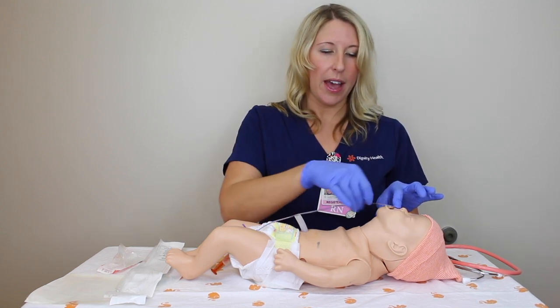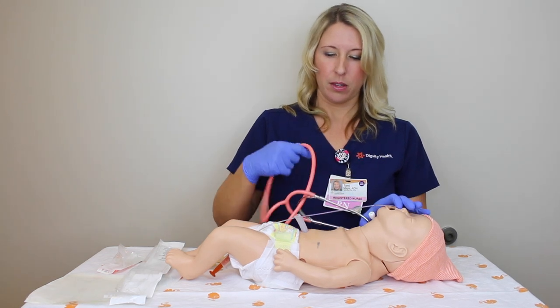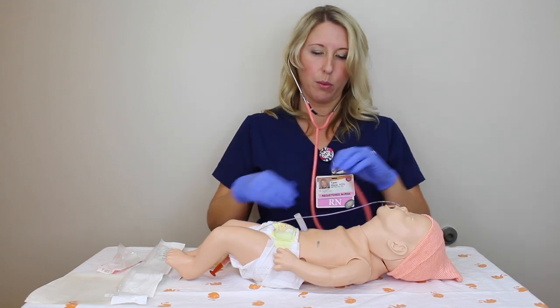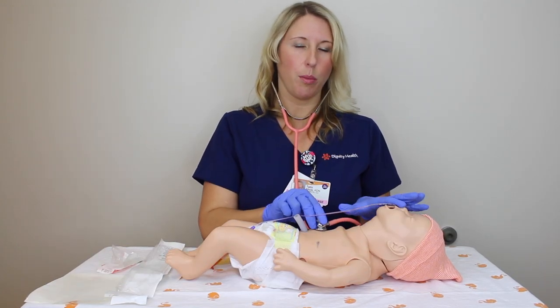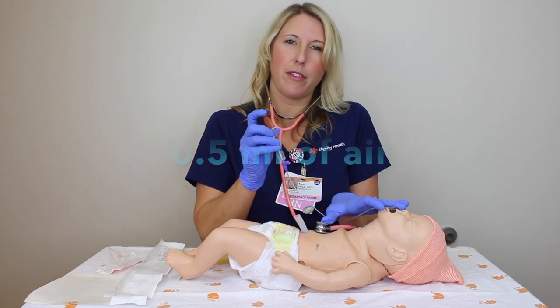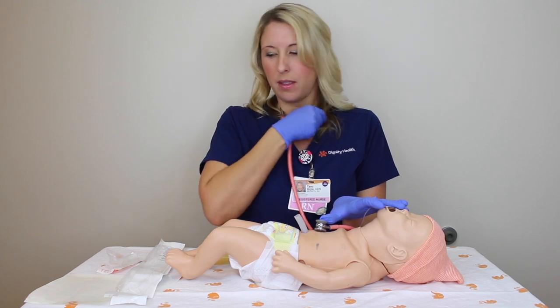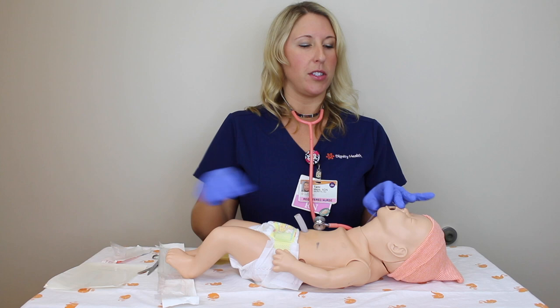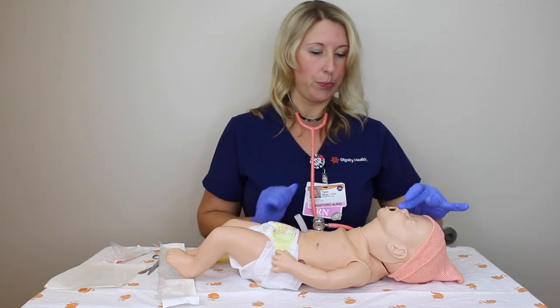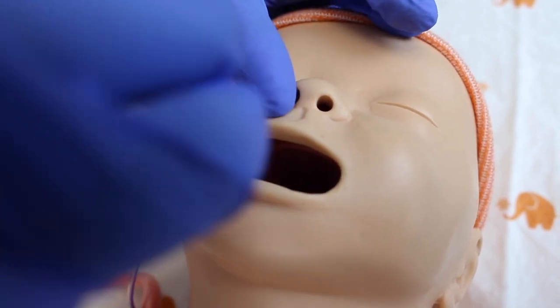Sometimes there is only a small amount present in the tubing. The other way to confirm placement is by auscultation — you will listen for placement. Place your stethoscope underneath the xiphoid process and push in about 0.5 mls of air; you should hear a thump or thud. Then take a piece of Tegaderm and secure your tube with the numbers visibly facing upright, and secure it with Tegaderm.